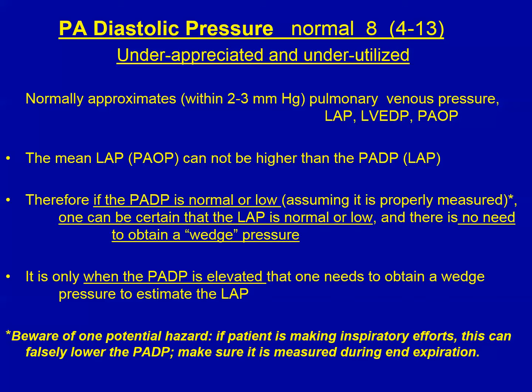However, beware in the spontaneous breathing patient that there can be anomalous low diastolic pressure during inspiration.